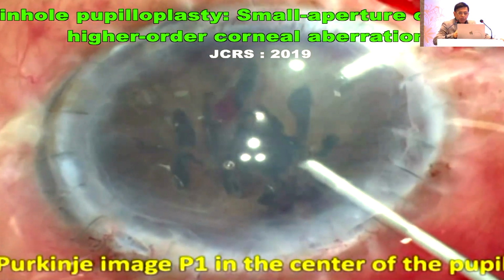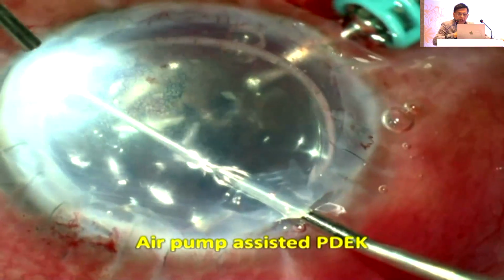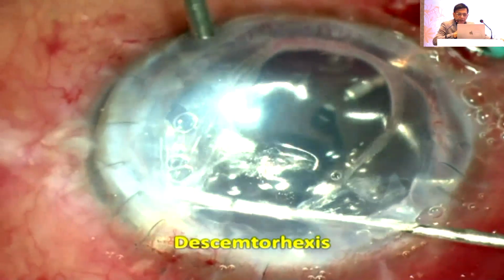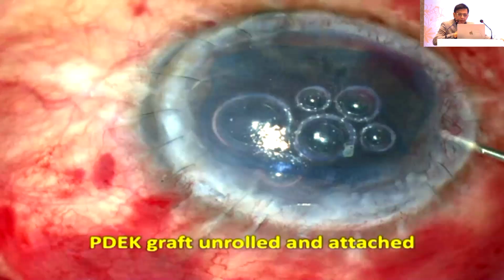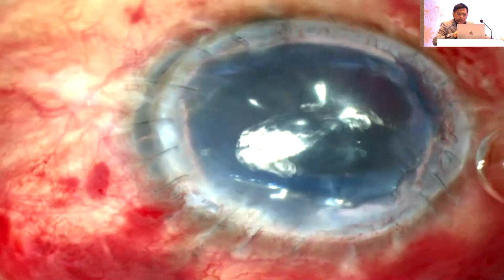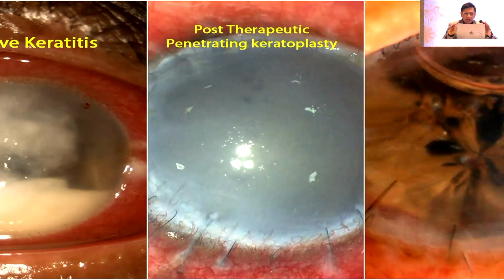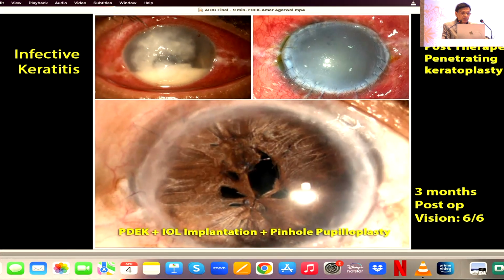Once that's done, the next step for me is to do the PDEK on it. Again, you can see we created the bubble there, remove the Descemet's endothelial complex, and once you have done that, you can see I'm injecting this graft there. Once that is done, you'll see the patient post-operatively. Look at that infective keratitis, post-therapeutic PK, and you can see now 3 months post-op, the patient's vision is 6/6.